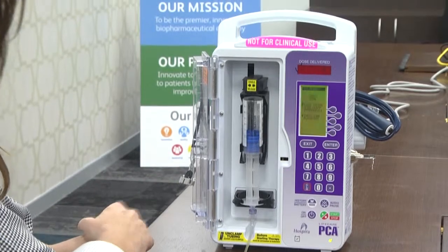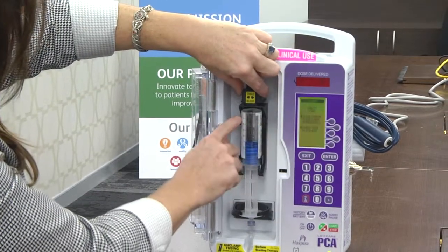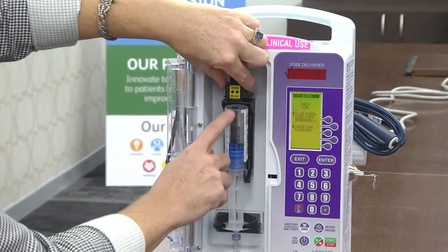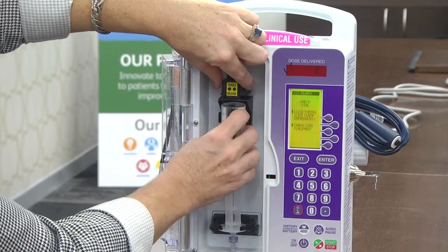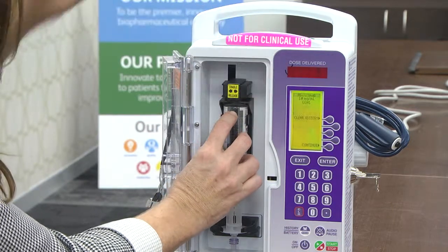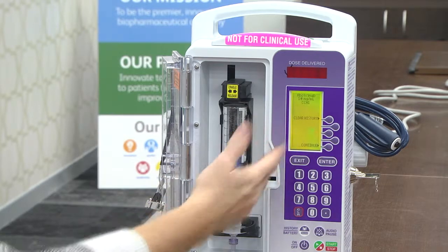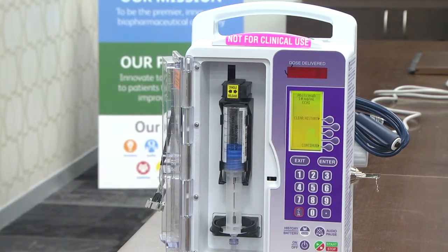Now I'm going to check the placement of the entire syringe. I can see that it's not properly inserted here at the top of the cradle, so I'm going to gently push that in. Now it's able to read the barcode, and we're on the appropriate screen where we can begin programming.